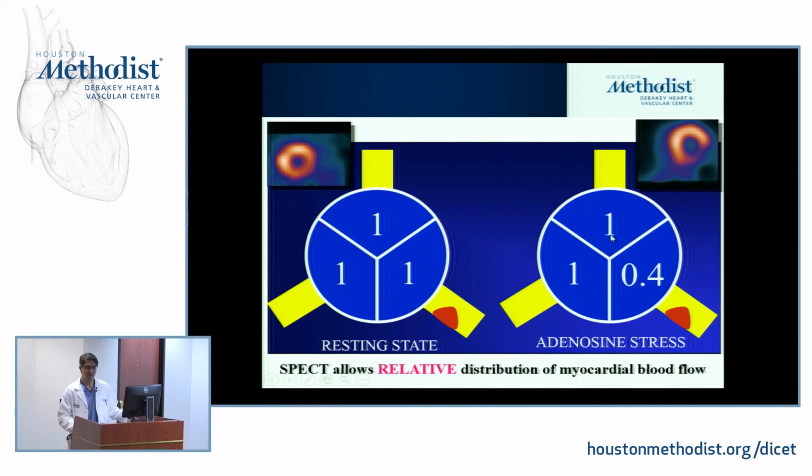Because now the normal myocardium will be bright, whereas anything that was served by a stenotic artery will have less coronary blood flow, less radiotracer uptake, and then fewer gamma photons to emit, and a hypoperfused image. So this is a very, very important principle of why we need stress to create this flow disparity between normal and stenotic arteries.